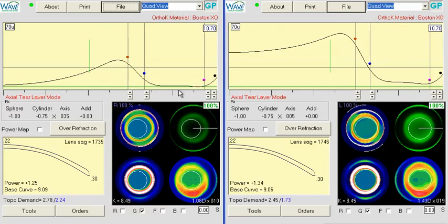Whether or not this works as a first lens, I'm not entirely sure. Again, the dynamics with the post-LASIK patient are probably a little bit different, but I think this should get you a little bit more molding than you were initially getting. And then I would do the same thing for the left eye.